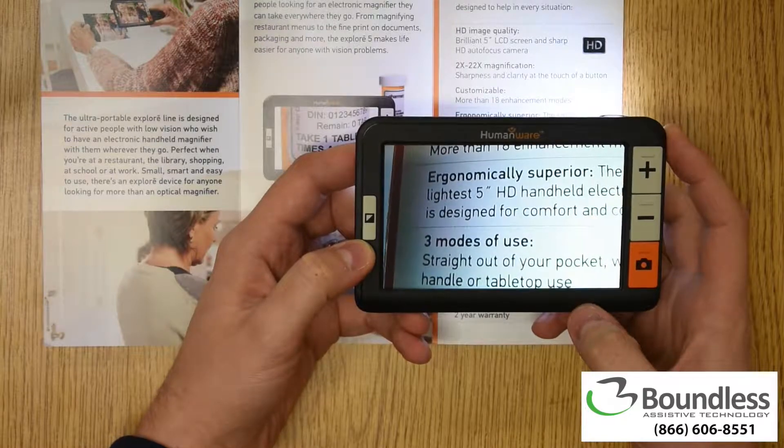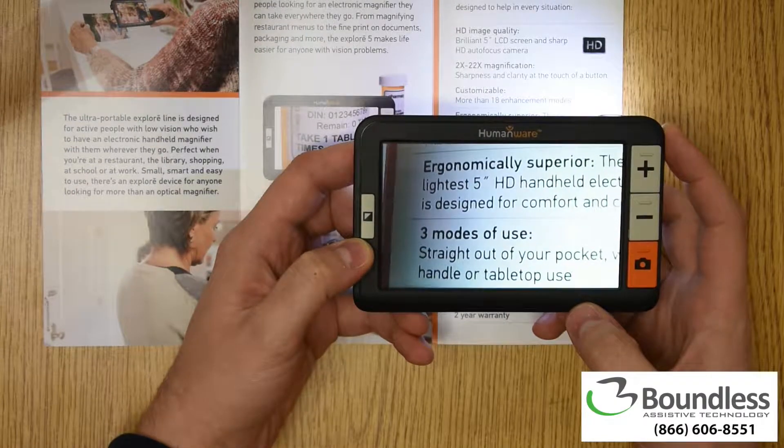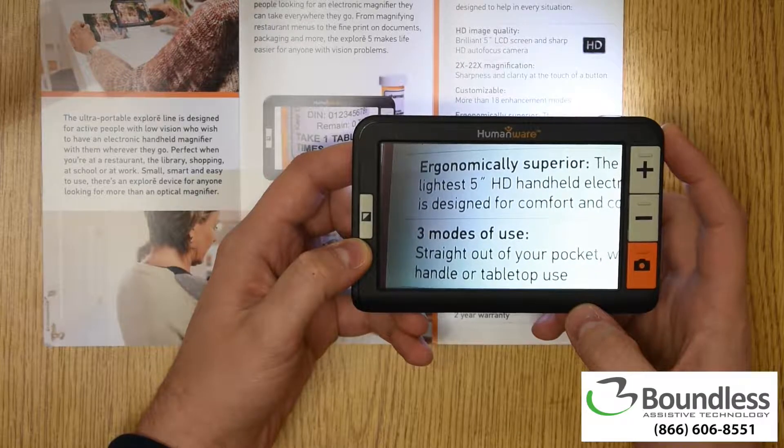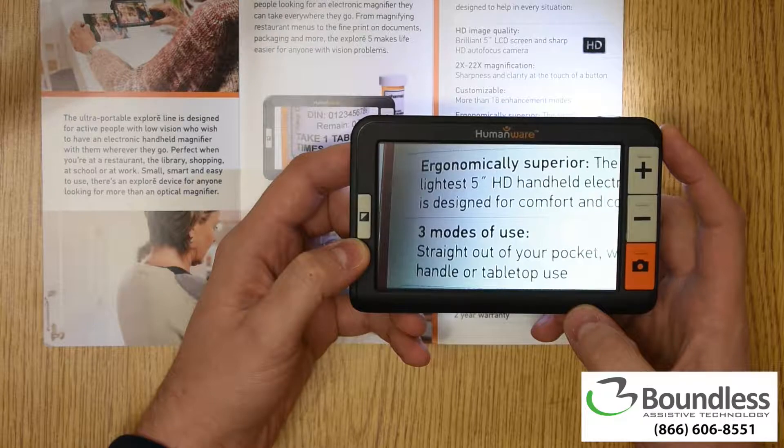Boundless AT is proud to show you the Explorer 5 from HumanWare. This is a 5-inch HD handheld magnifier with a sleek, lightweight design and folding handle for varied use.